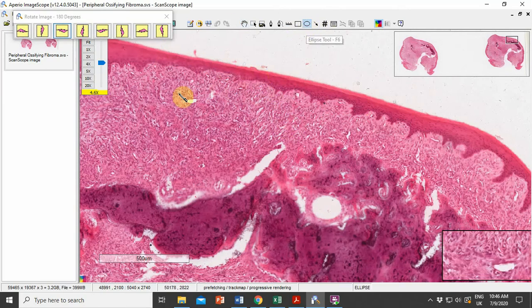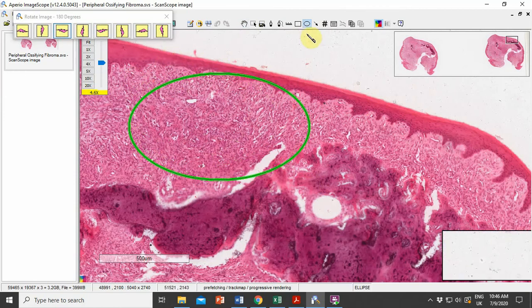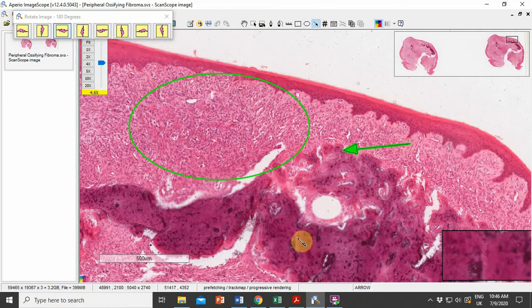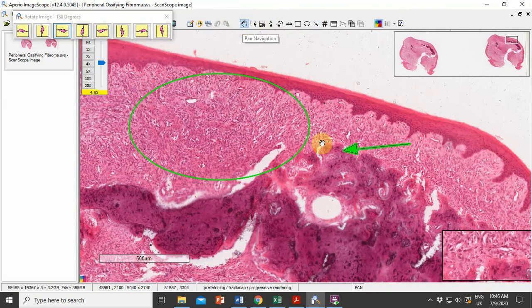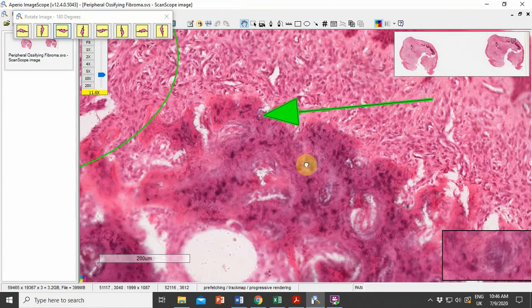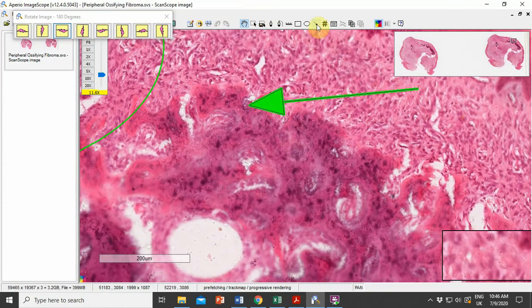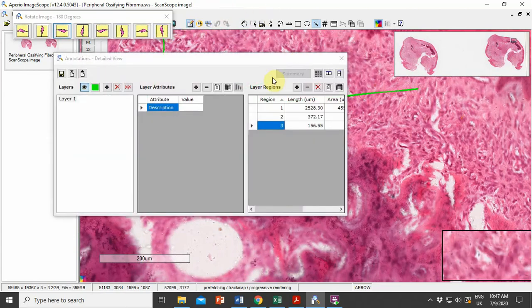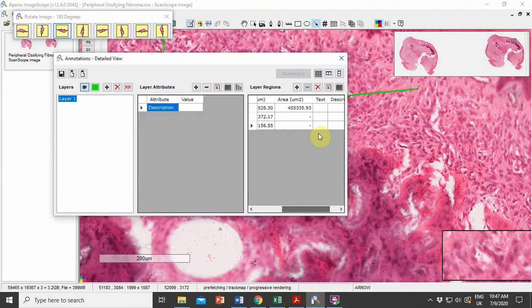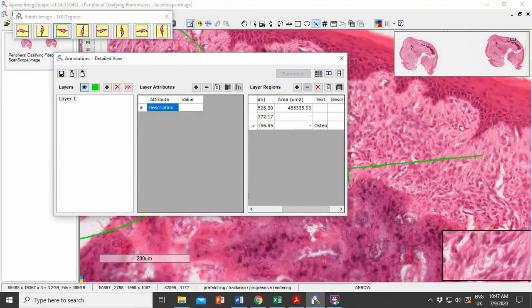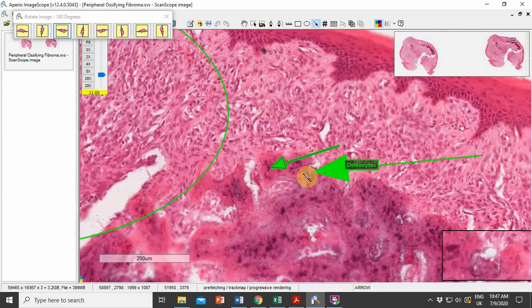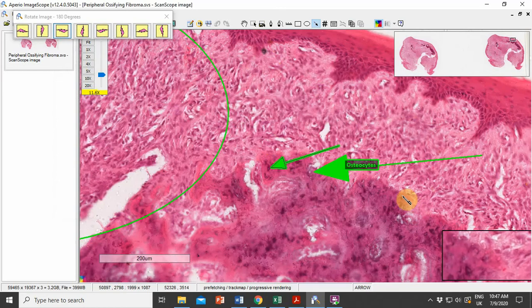The underlying connective tissue stroma is highly cellular and also shows a mineralized product within the connective tissue. Further magnification reveals that these are irregular trabeculae of bone showing osteocytes within lacunae.